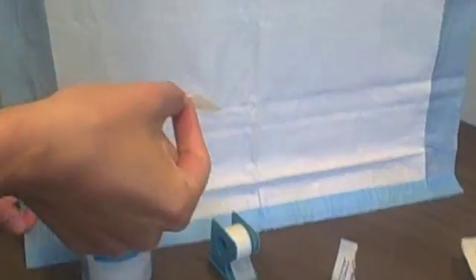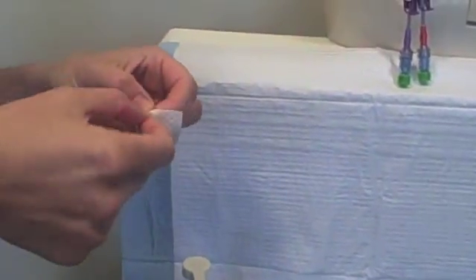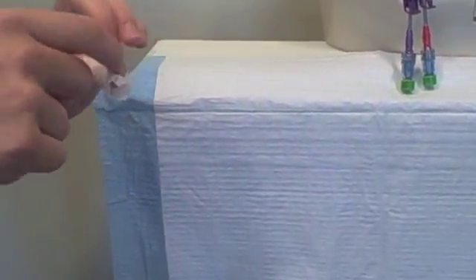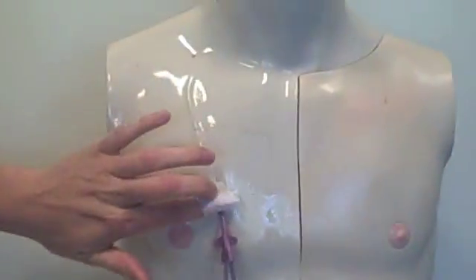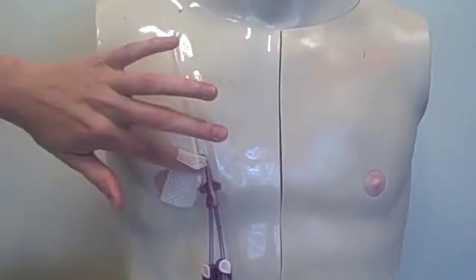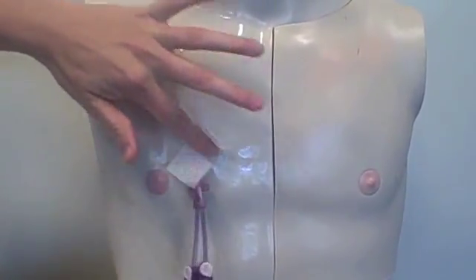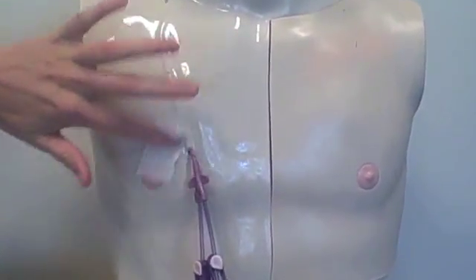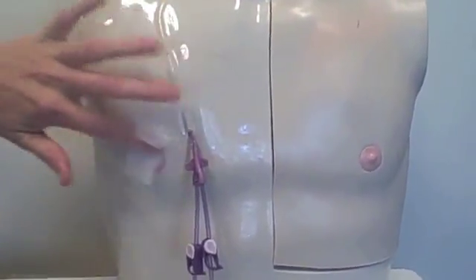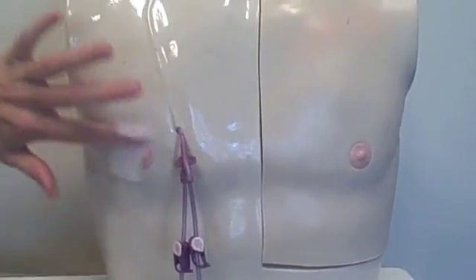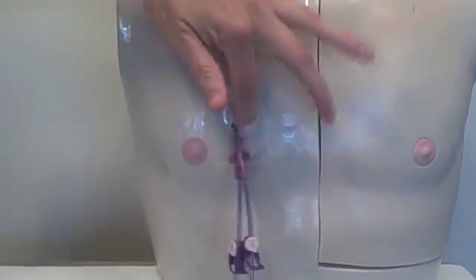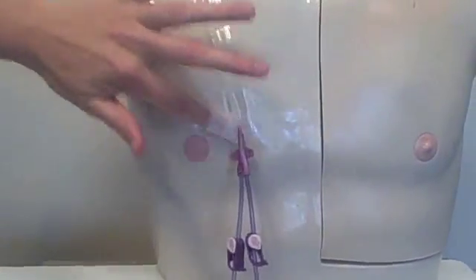Start by touching only the edges of the first alcohol wipe. Remove it from the package and clean around the insertion site in a circular motion. For better control, try opening up the alcohol wipe and wrapping it around your index finger. Start where the catheter is inserted into the chest and move outward in a circular motion about 3 inches in diameter. Imagine a target and start on the center. Move outward away from it. Repeat with a second alcohol wipe. Discard each item in the trash as you go.